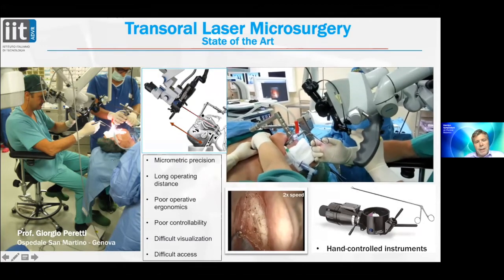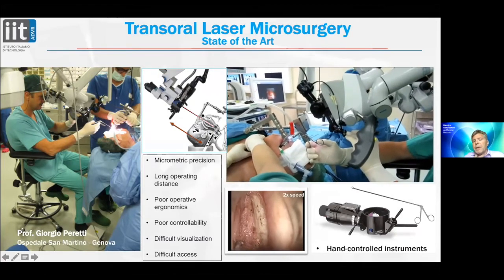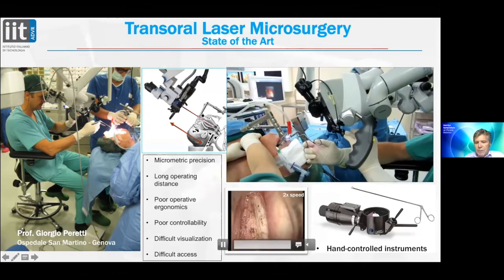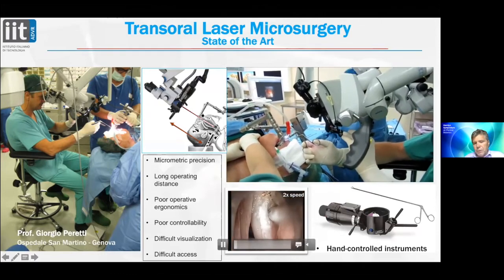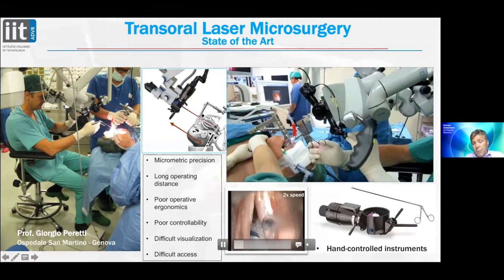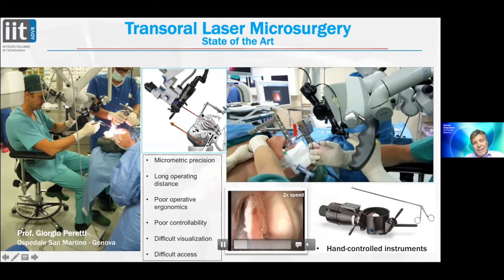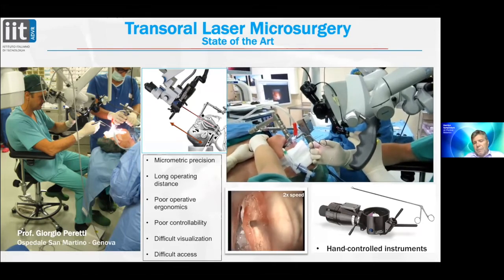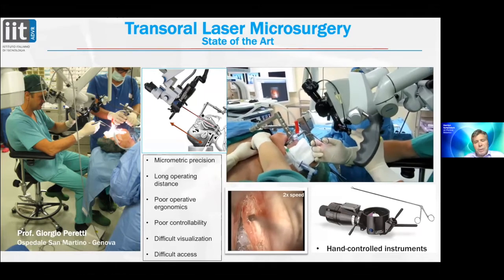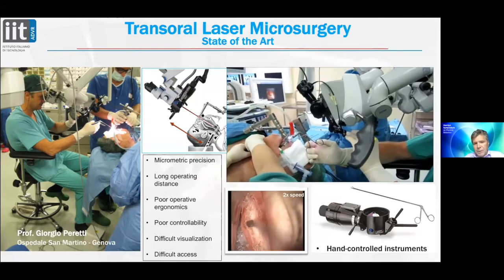So what we actually have is operations on the vocal cords at the back of the throat. And we see a close-up of this system. These are the vocal cords. These are typically 10 to 20 millimeters in length. Very small structures, very easily damaged. Any damage to them during the surgery will cause a change in voice, which actually has important psychological impacts.